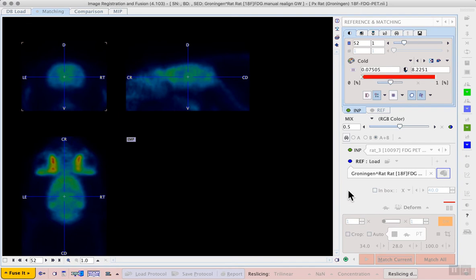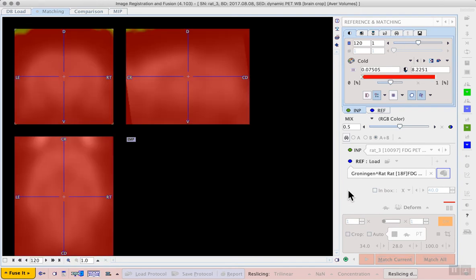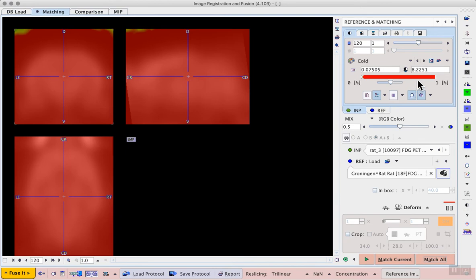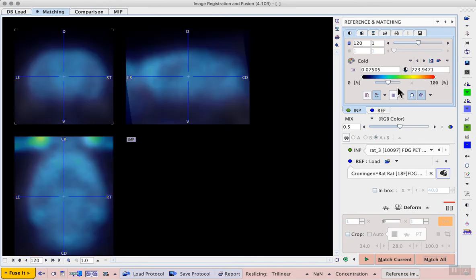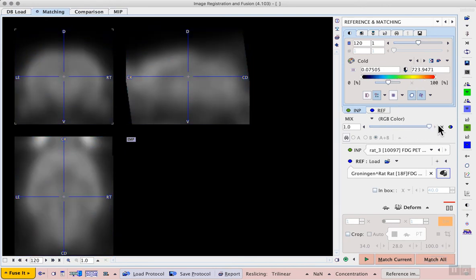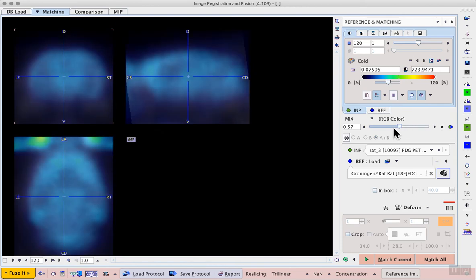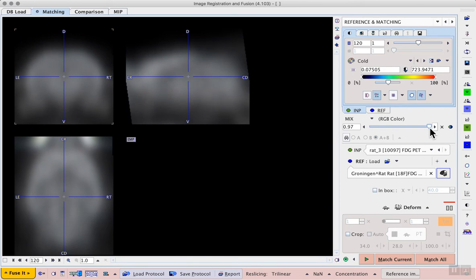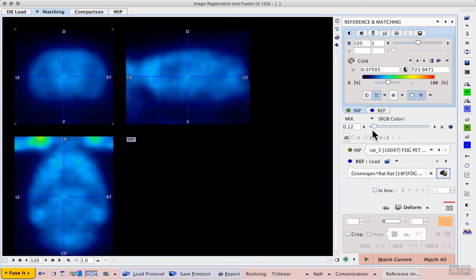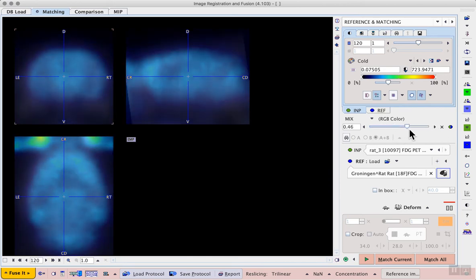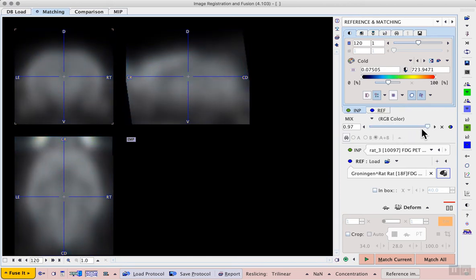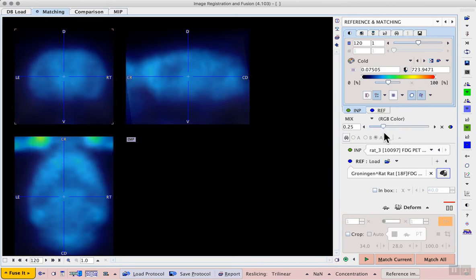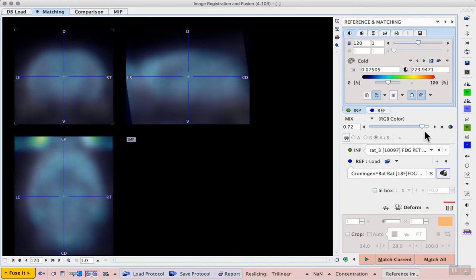Then the template will be loaded and we will see the Fusion display of our two images. As usual, we can use the Fusion controls to see how the images correspond. The template image is very smooth, and as we move from one side to the other of the Fusion slider, we can see the difference in the shape.